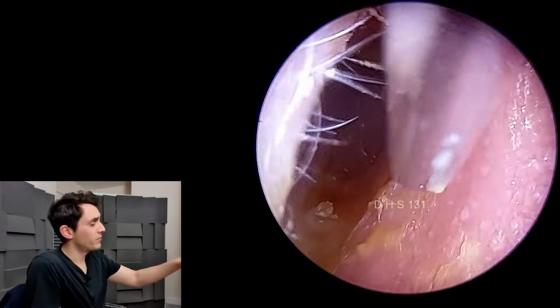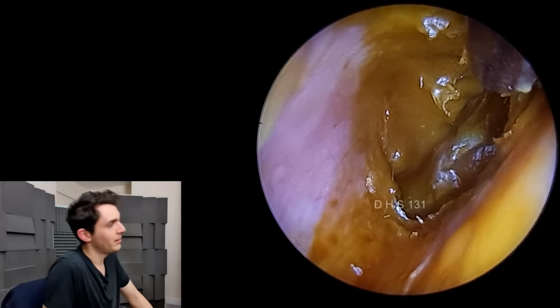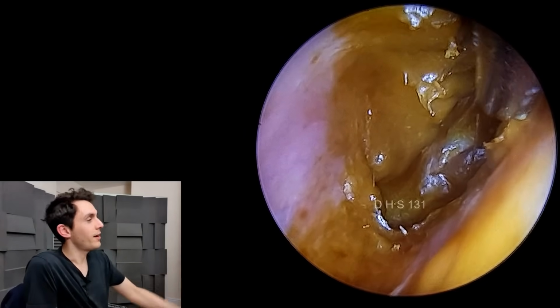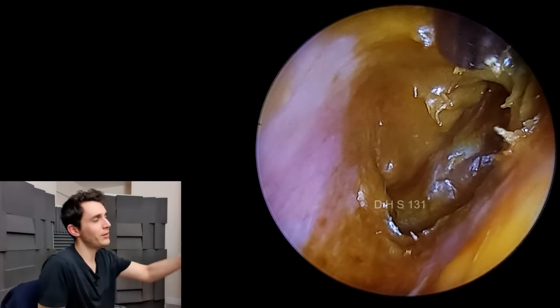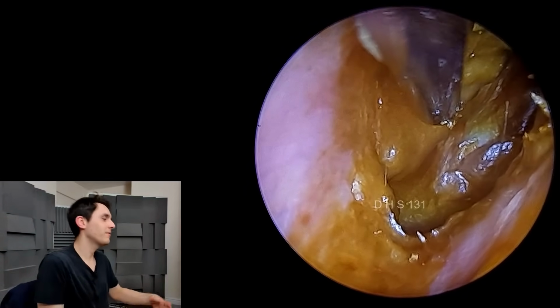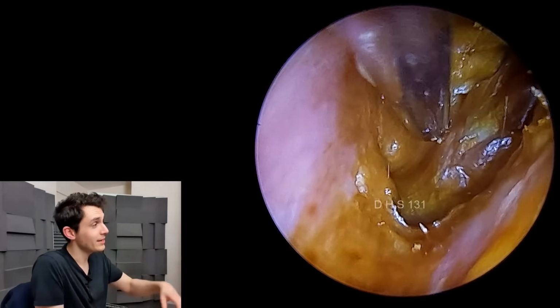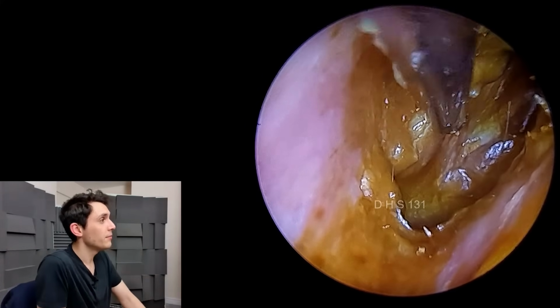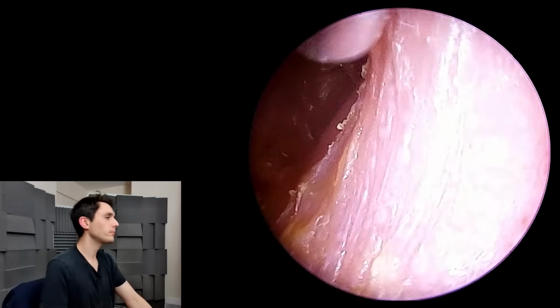Just to comment on what you're seeing here, the first half of this video contains a lot of faffing around before the good action starts. What I'm doing here is really just getting a feel for how to best approach the case. And again, that's why I'm going in very gently and seeing what I can prise away. But ultimately, sodium bicarb drops are going to need to be administered here.